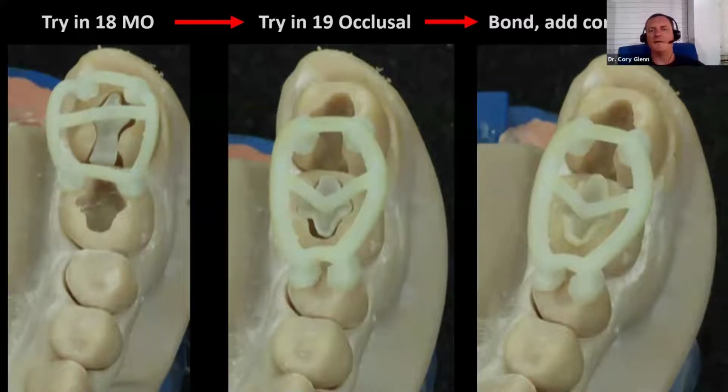Well, with this, all of those key areas of anatomy are being located ahead of time. And these little feet index it into the tooth so that it's in the perfect position as their pre-op anatomy or their wax up. If their tooth was bombed out and you had done a wax up in Blue Sky Plan, same difference. And so at this point, you just place some composite into the prep and you squish this down, index it on those adjacent teeth until it's fully seated. And as you see, it squishes out some excess there on the far right.